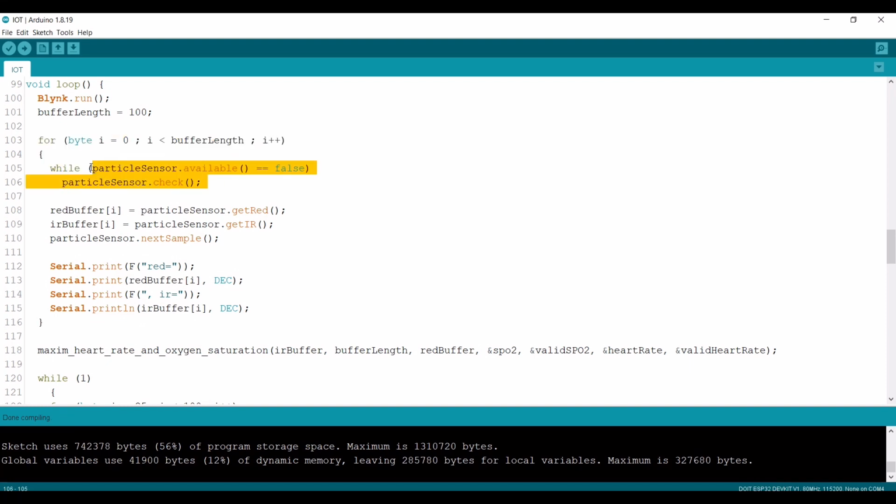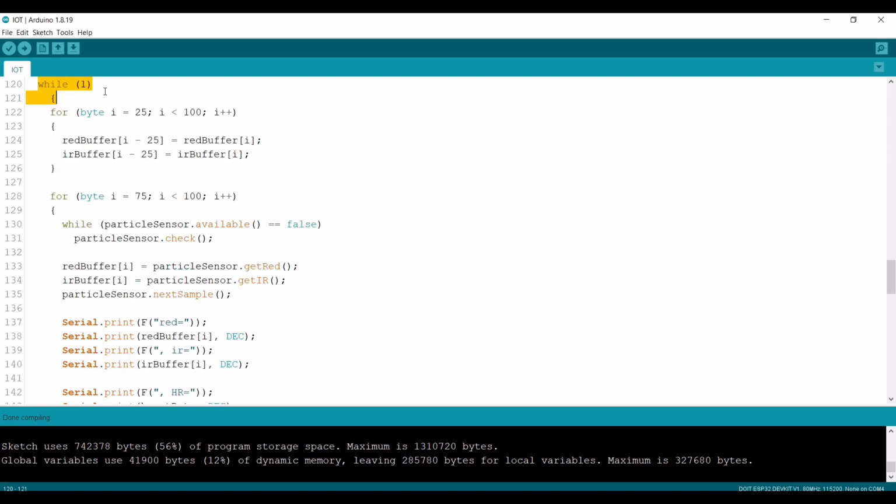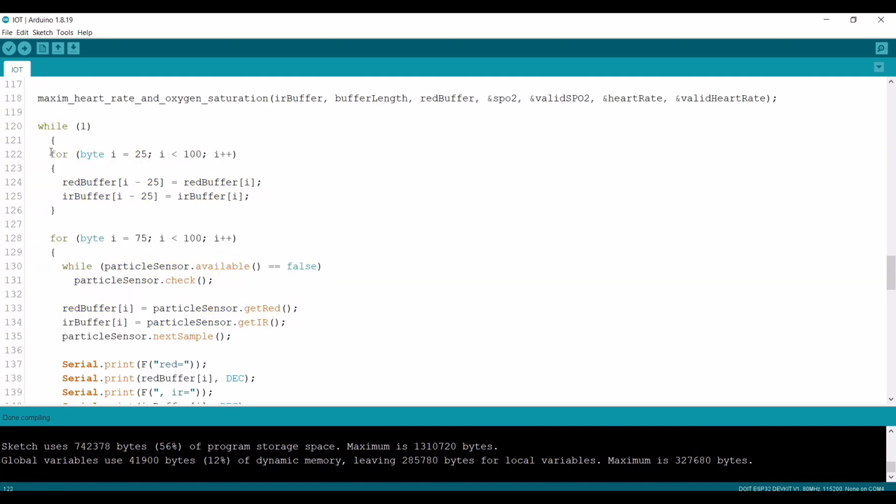This one is to check the data. If there is no data, let's check the sensor. And here is to get the red LED and the infrared LED values. And when finished, go to the next sample. And here is to display on the serial monitor, to calculate the heart rate and the SpO2 value. After the first 100 samples are received, the code continuously takes samples from the MAX sensor. And this one is for dumping the first 25 sets of samples from memory and shifting the last 75 sets of samples to the top.